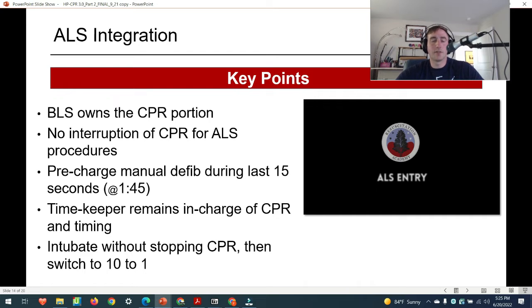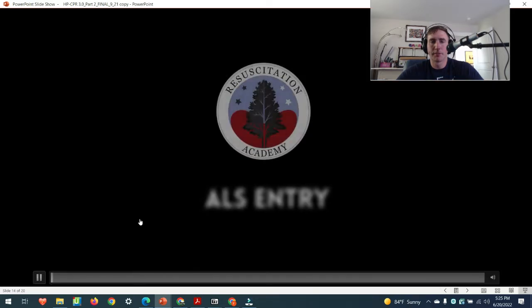they say, hey, we defibrillated a minute 30. We're about to analyze again. Maybe let them analyze again, right? Why delay that? If in 30 seconds they're going to shock again or at least analyze again, let them continue, get your monitor ready, and get someone on deck. All right, so let's see what this looks like.